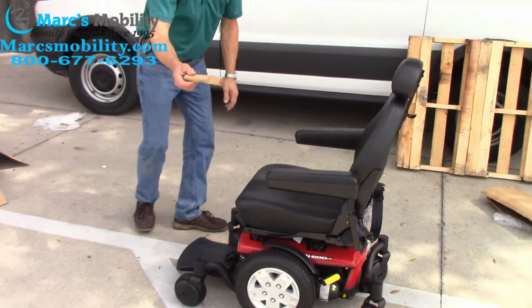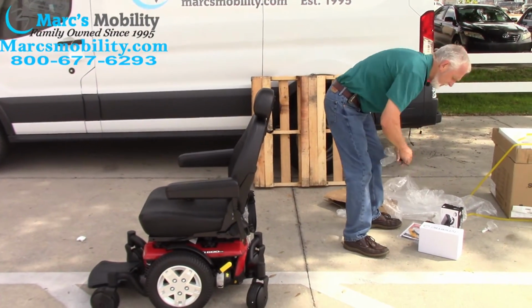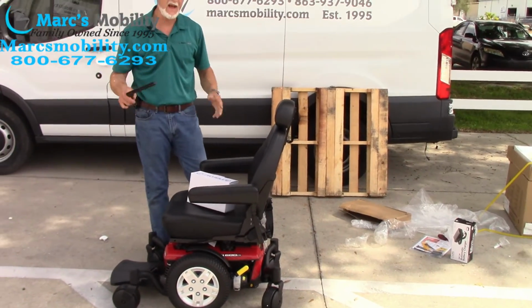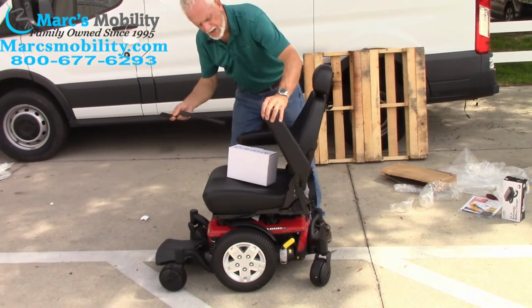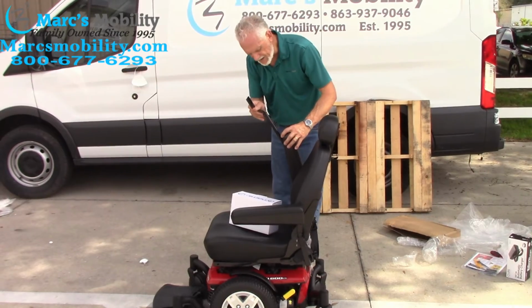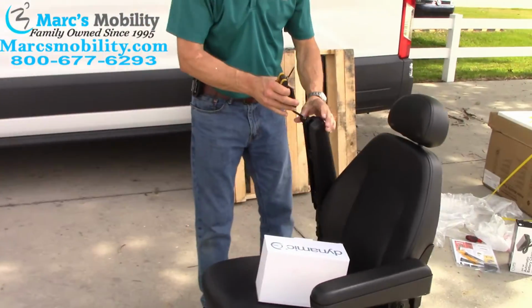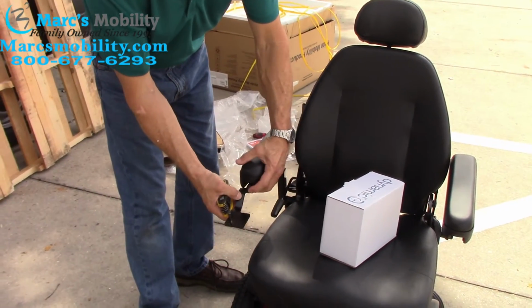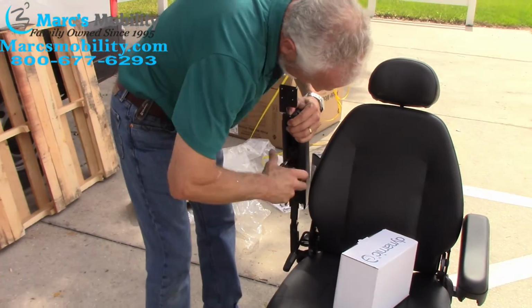Put the foot plate down. There's a little bit of cardboard still. Get rid of that. Now, you're going to take your arm. Now, I don't know what side you're going to be driving, okay? Most people are right-handed, but it doesn't matter if you put this on the left side or the right side. So you're going to put it in here. You're going to take your Allen wrench again. You're going to put it about the knob of the pipe, about level with the end of the arm, and you're going to tighten it up like this.